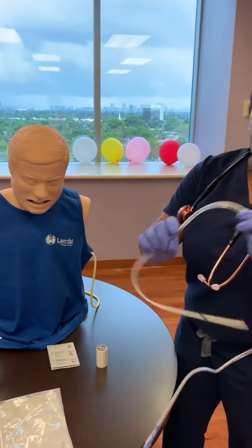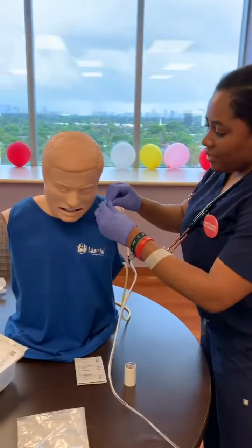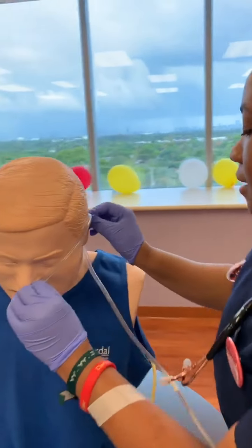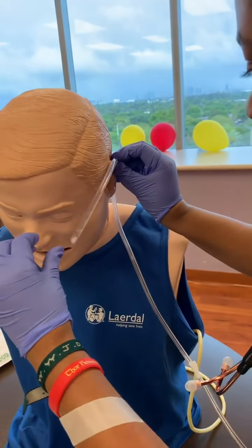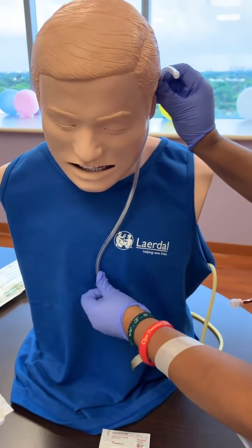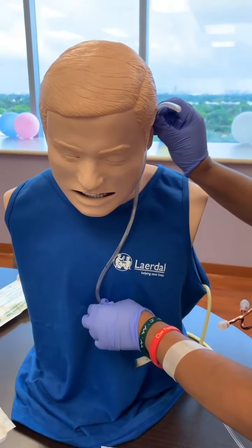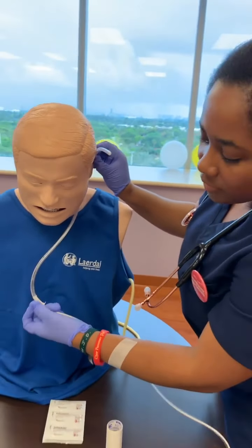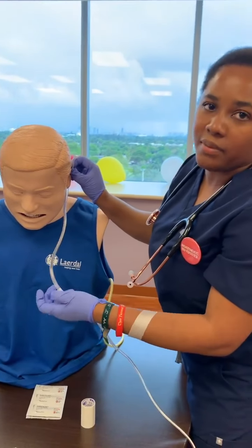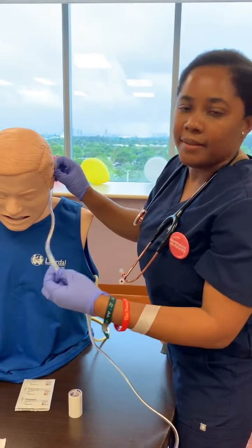This one I already have a piece of tape because my students were practicing, so just pretend that's not already there. So what you're going to do is you're going to measure from the nose, behind the ears, and then you're going to go down until the xiphoid process. And this is usually the marker for where your NG tube is going to be inserted. Having a tape marker there is really helpful in knowing exactly where you want your tube to land.